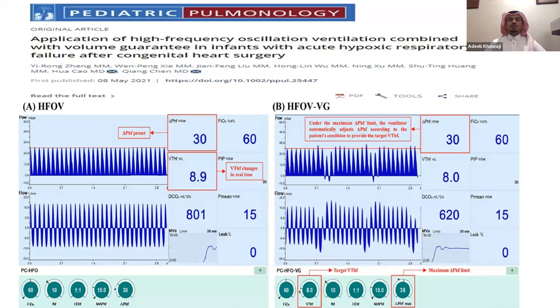That's why we brought these questions and the poll in the middle. And as you can see, in most of the poll questions, people are still not familiar. They don't like high frequency and don't believe in it. From my personal experience, I use it in this ICU. I wasn't comfortable initially. Then I used it in 5 patients. 4 really improved with it. The 5th one, I had to bridge to ECMO. So I think it's our comfort zone rather than our understanding of physiology.